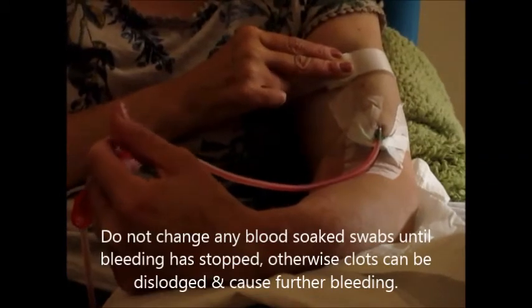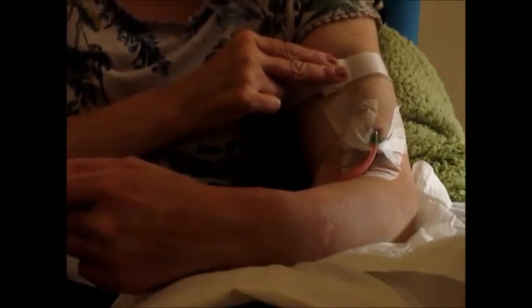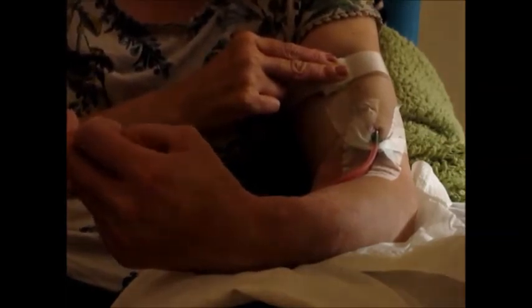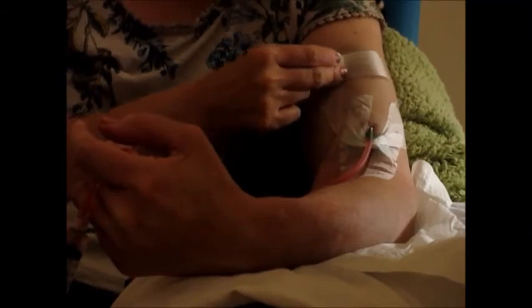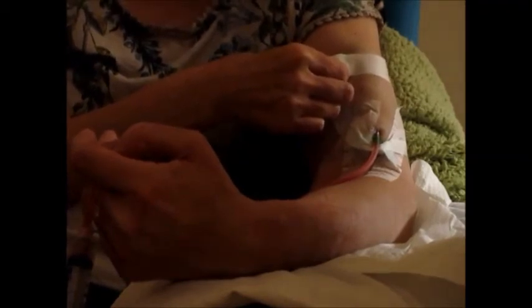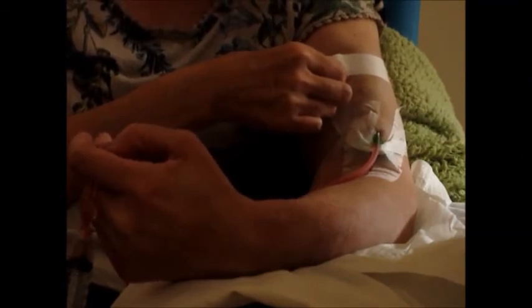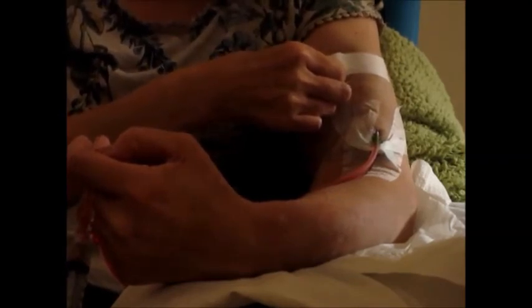Just to mention something I may have forgotten at the beginning of the video: the pumps on the machine — the faster they're going round, the faster the blood is actually cleaned and the more toxins are removed. People who have lines in are not able to get a very high pump speed, because it can't tolerate such a high flow. Also there are different size needles depending on the individual and the size of the access, which will give an increased clearance as well.